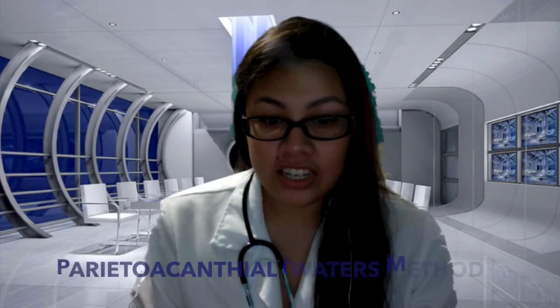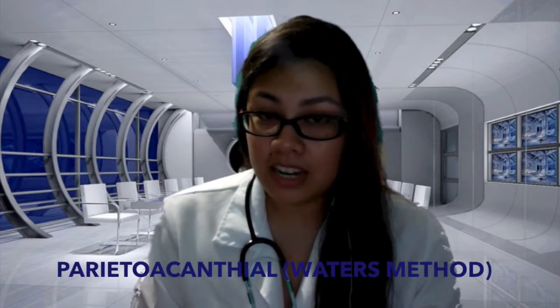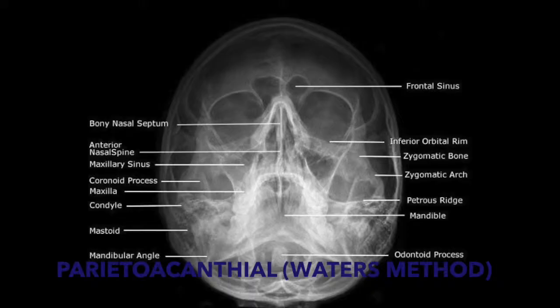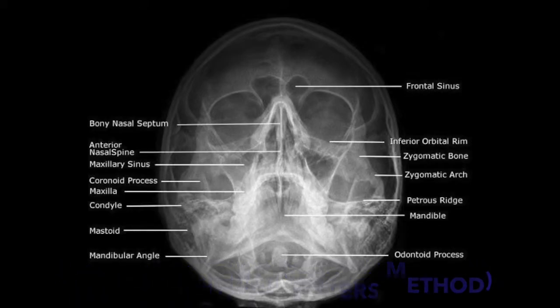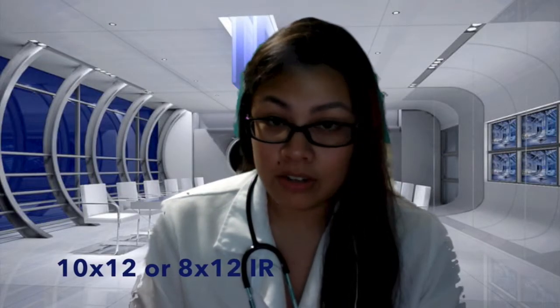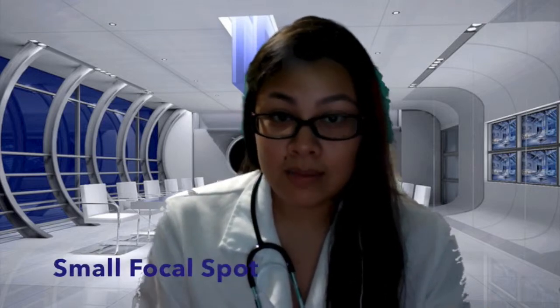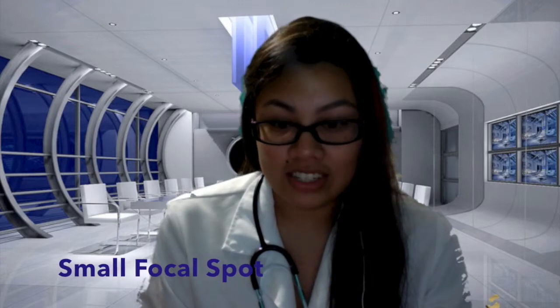In this projection, fractures are mainly tripod and Lefort fractures, and neoplastic/inflammatory processes are shown. Foreign bodies in the eye also may be demonstrated on this image. You can use a 10x12 or 8x12 IR lengthwise, 70 to 80 kV range, a small focal spot, and a minimum SID of 40 inches.